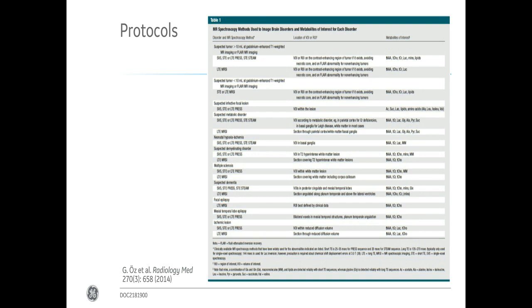There is recently, or it's already 4 years ago, a publication in Radiology about the clinical use of spectroscopy, and this is a consensus paper, a consensus of all the spectroscopists from the ISMRM study group concentrating on brain disorders.